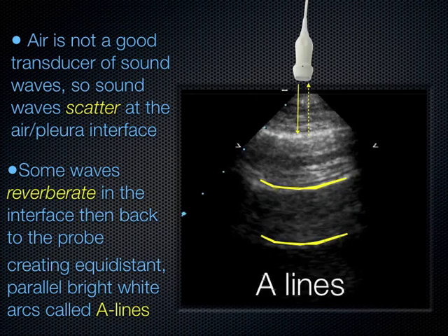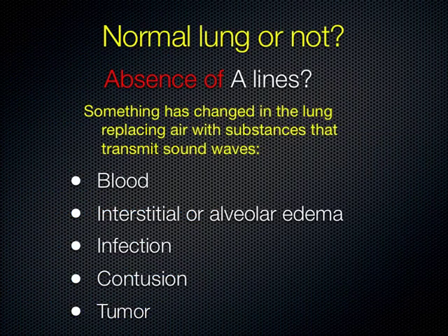It doesn't really depend on what frequency you use. You'll see this artifact because there's such a huge difference between the acoustic impedance of the pleural line and the air next to it that there will be a resonance phenomenon with most any probe you pick. It doesn't change. It's still the same distance. The depth of the line is from the chest wall to the pleural line, that is the spacing. You'll see multiples of that as it goes down. Okay. Good questions.